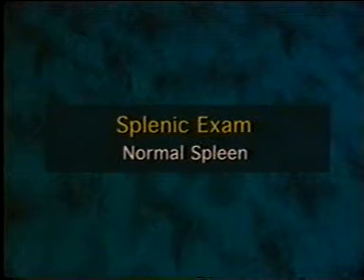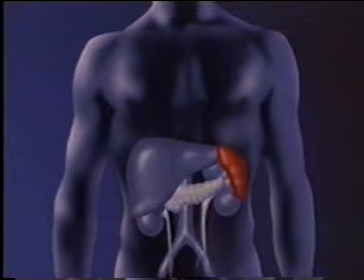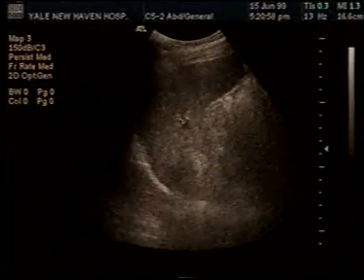A basic AIUM splenic exam involves adequate images of the spleen. To get the best image of the spleen, tip your patient left side up and scan around the lower costal spaces until you find it above the left kidney. So this is the left side, and we can see the spleen.